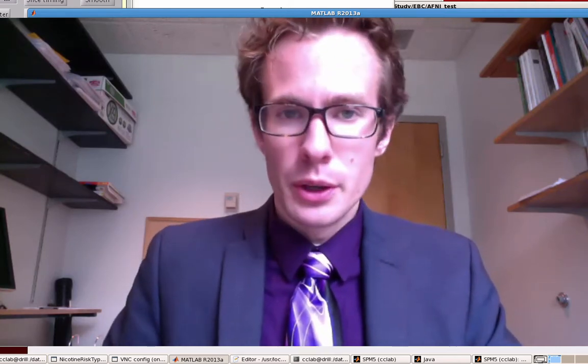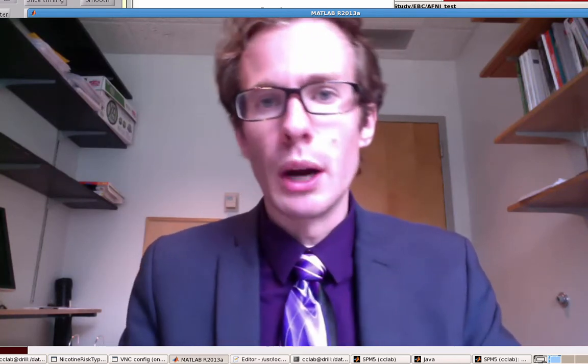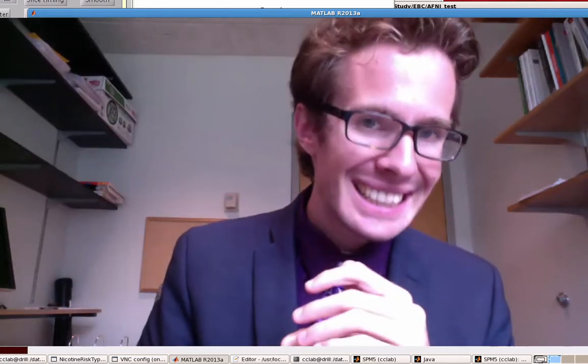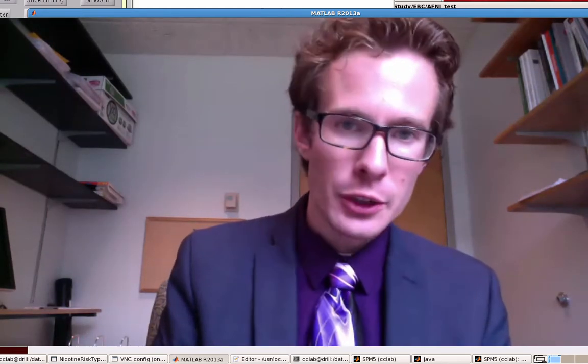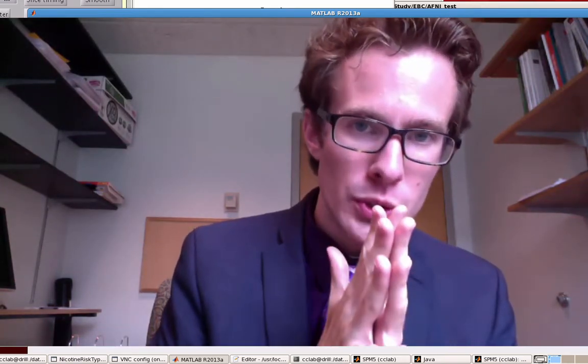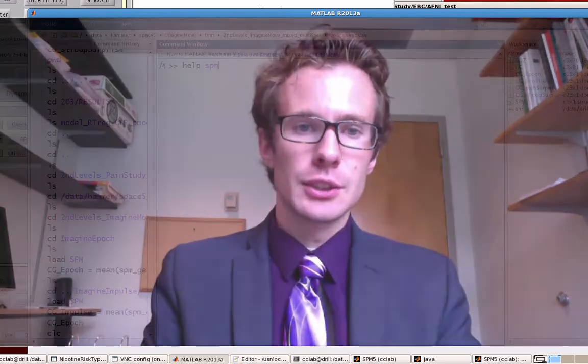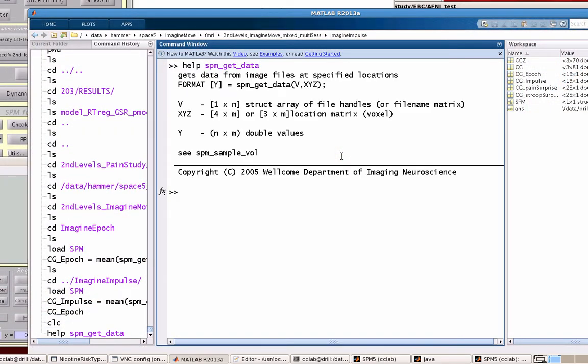Now that we have the coordinate sets for these ROIs, we can use a command called SPM_get_data to extract parameter estimates, contrast estimates, anything you want from those ROIs. The first thing it wants is a struct array of file handles - a fancy way of saying it wants a path to each contrast used in your analysis. Imagine we had a second level analysis with a number of subjects, and we want to average over the ROI for each of those contrasts for each subject.